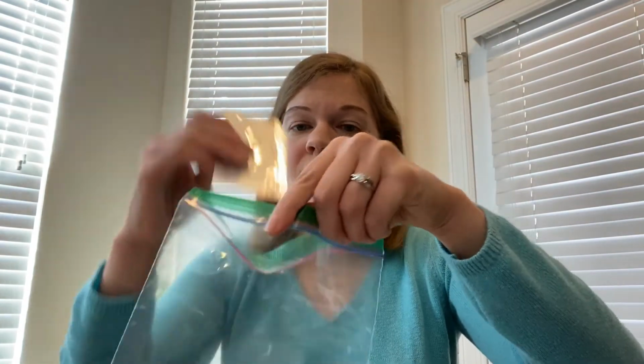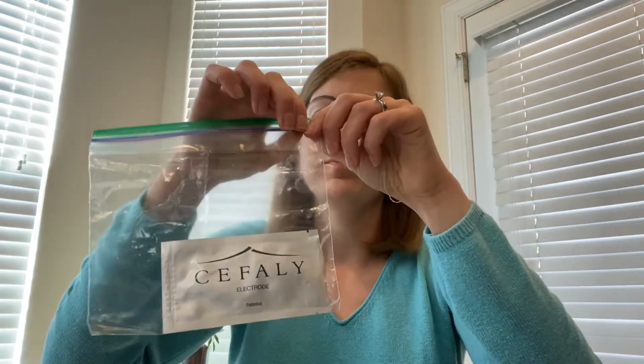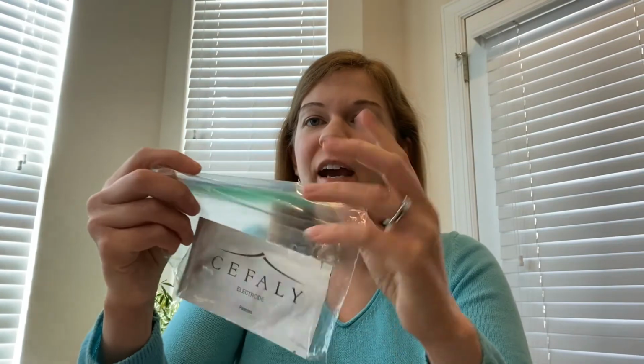Okay, so I'm going to take this back off for now. Again, it peels right off. I'm going to put it back on its little plastic sheet here. And what I like to do is put it back in its little bag that it comes in. So I'm just going to stick it right back in this bag. But on top of that, in order to keep the adhesive sticky as long as possible, I also put it in a Ziploc bag. So I'm going to put it in the Ziploc bag, try to squeeze all the air out of it, and zip it up.